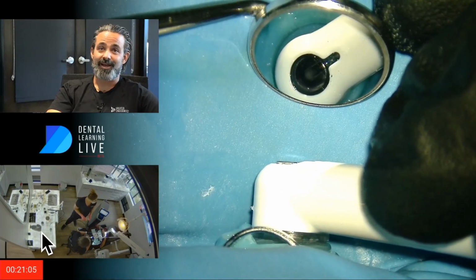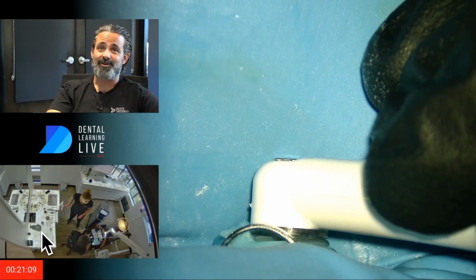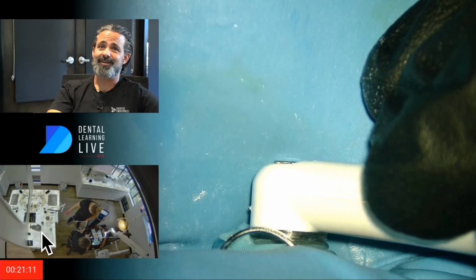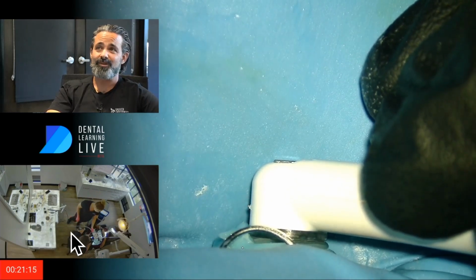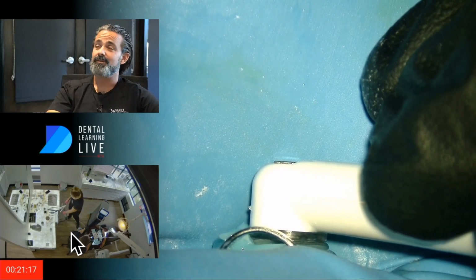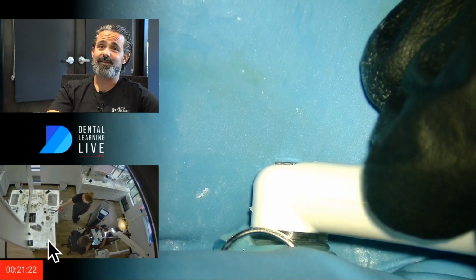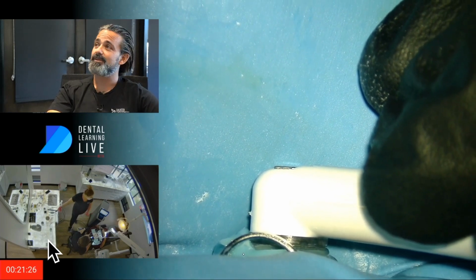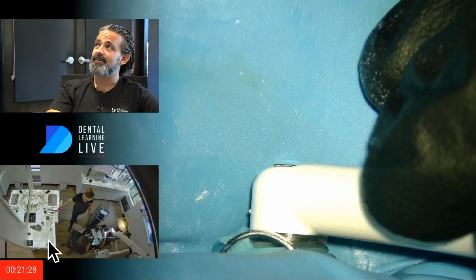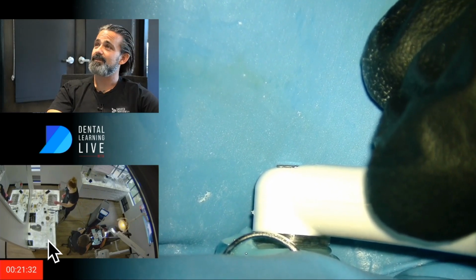Okay, almost done. I know it seems like we're watching weeds grow. Oh my gosh, but that's how it goes. I'm not that funny of a character, so you could be telling jokes. The problem, if you're really funny, is your patient's head will be bobbing. So don't be too funny, just funny enough to keep your staff engaged and your patients from falling asleep, or let them fall asleep. Then dancing fairies and sugar plums in your head. Only around Christmas though.